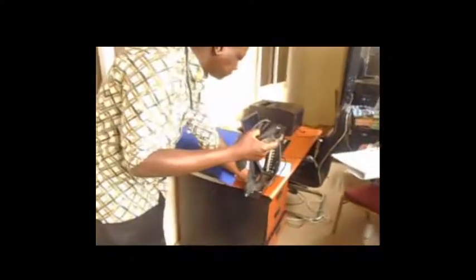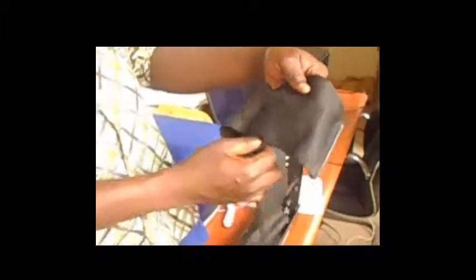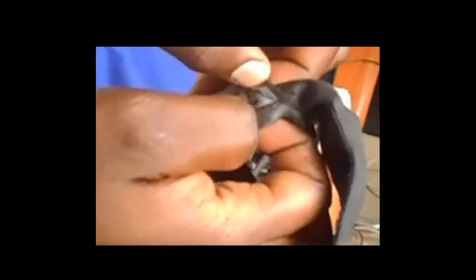So we have the blood pressure cuff. When we talk about the blood pressure cuff, this is the cuff — all of this is the blood pressure cuff. The blood pressure cuff has an area that is inflatable, and we call that inflatable area the bladder. Most often it is the bladder side that we need to put on the anterior aspects, or the inner aspects, of the arm.